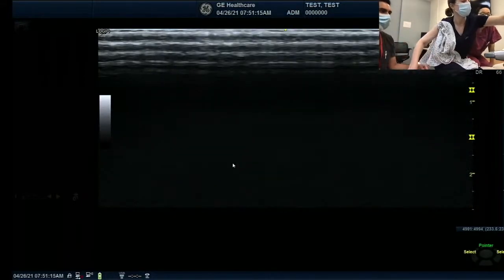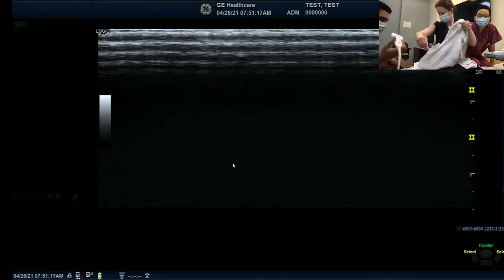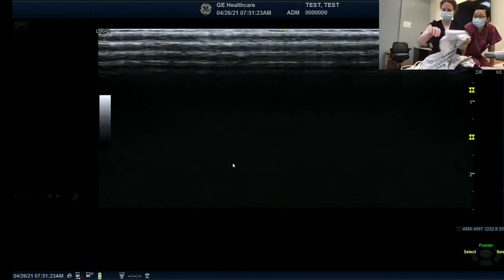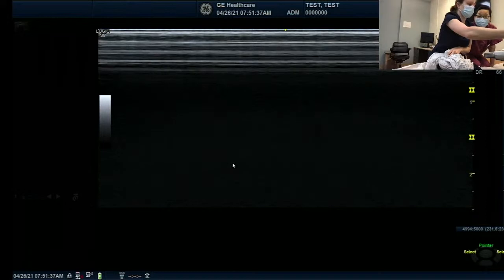Hopefully everybody can understand the radial nerve pathway from the axillary artery, triangular interval, spiral groove, supinator, and then I think that's it, right? Between the first and second compartment, and the fourth compartment is going to be the deeper branch.